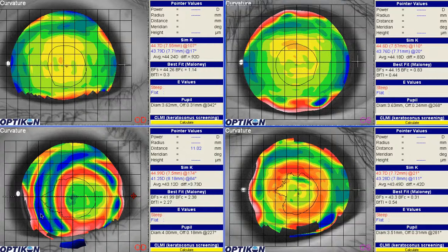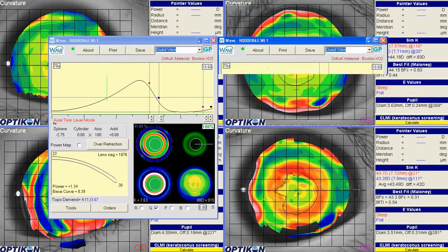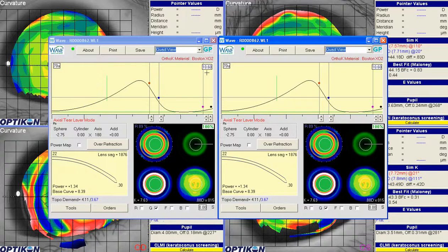So I'm going to bring up 2 copies of the lens for the patient's right eye. The same lens in both windows right now. It's the lens that the patient is wearing at the time. And so first thing I would change is we'll bump this up to 10.8. And by doing that, you can see that we've increased the sagittal depth of the lens, and that in itself will help, I think, with centration.